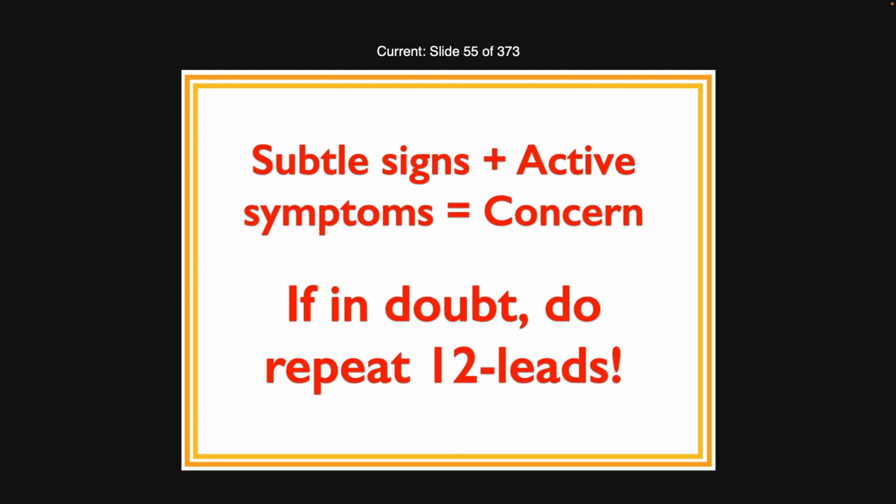That's concave upwards, okay? So when we talk about T waves, a significant finding that we will learn about probably when we do pericarditis, so probably not till next term, is the phrase concave upwards. So if you have a T wave that goes like that, that's concave upwards. Remember, this is concave, this is convex, if we're looking at the top, right?